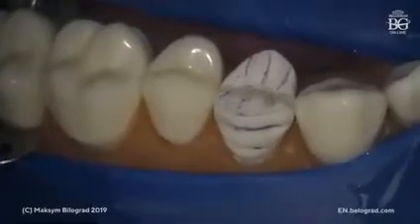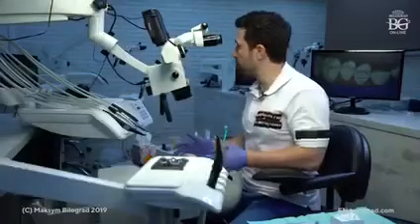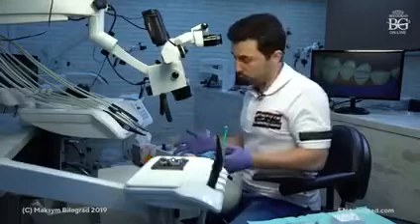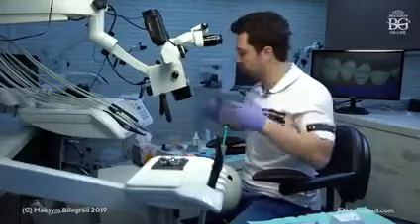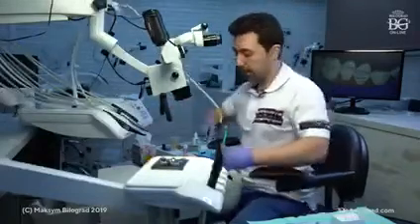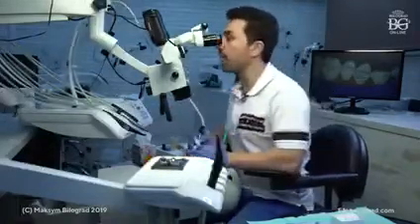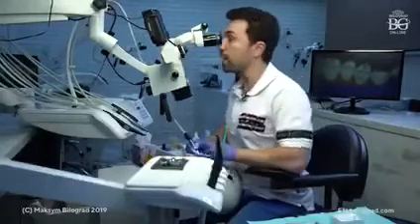This position for the patient is not dramatic. It is not super comfortable, but it is resistible. If you put some pillow underneath the neck, your patient may stay in this position for a pretty long time. So don't worry, you will have no problems with your patient's position.